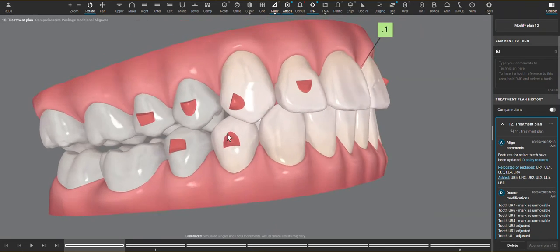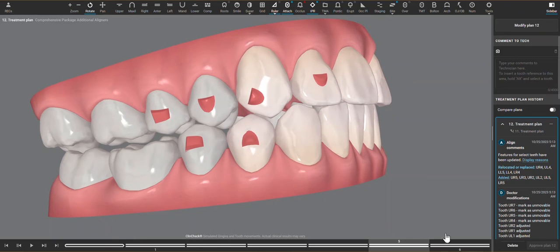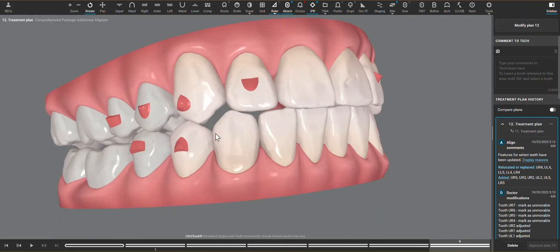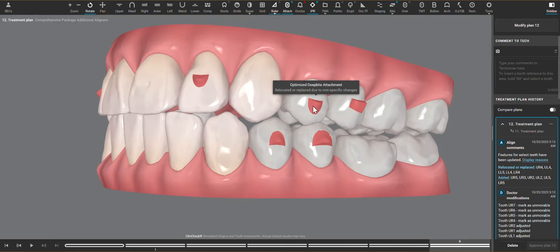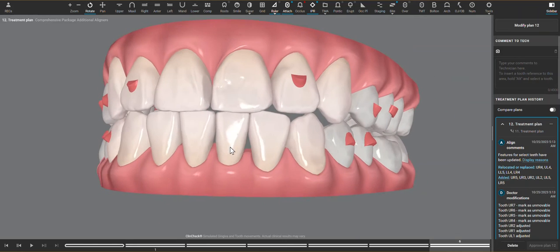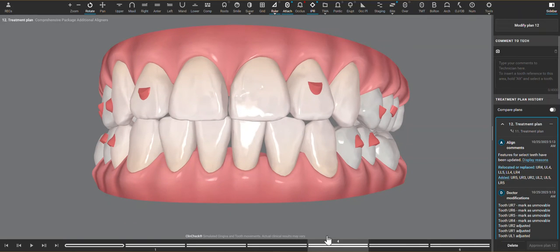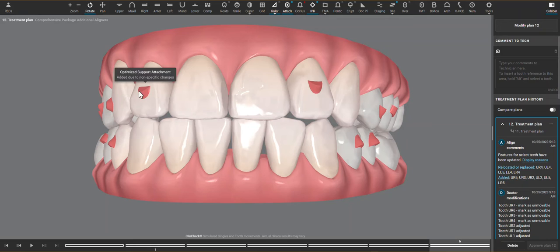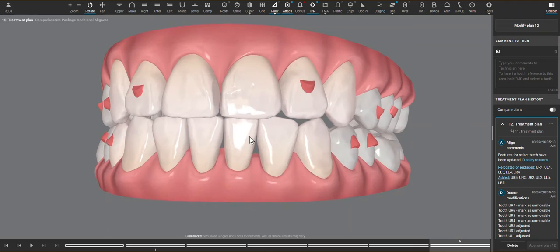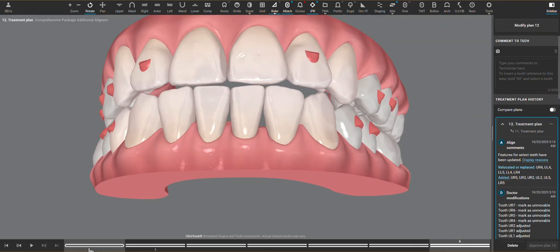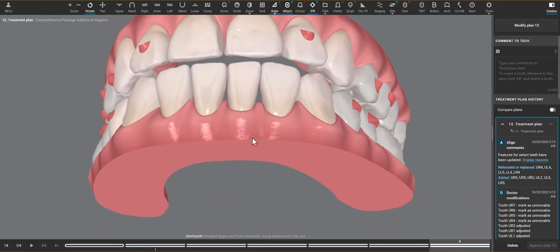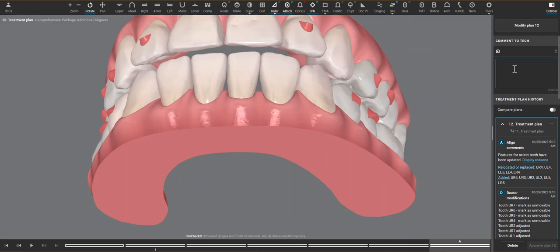Here is what the case looks like with predictable anterior movement, where none of these posterior teeth are being moved. They are being held as anchor teeth. We have retention and deep bite attachments so that the aligners are well engaged with the arch for upper incisor intrusion. Other retention or support attachments are very helpful for these long rooted teeth, and a similar aspect for the lower anterior. What isn't shown here are the bite ramps. Those are not able to be placed by the 3D controls, so we would need to request those from the CAD designers.